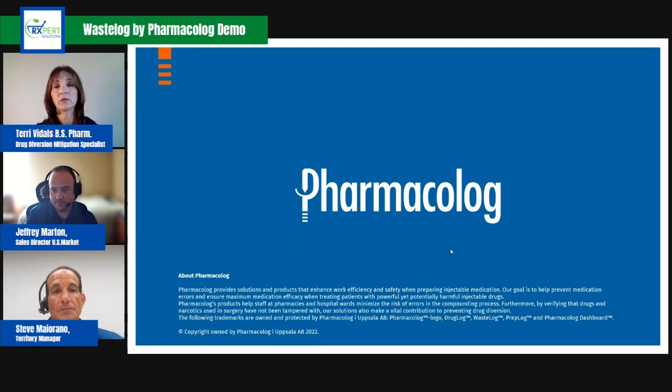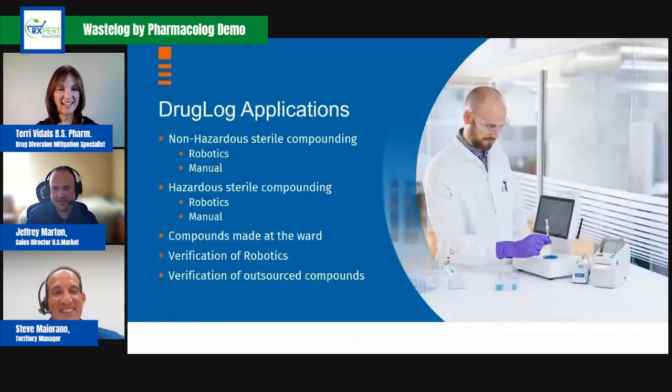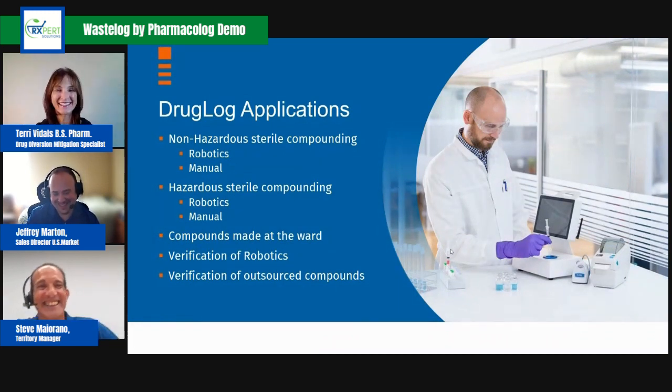Right. Yeah, no, that's a good point. So do you have any customers that use it specifically in the pharmacy for compounding, double checking, and quality assurance? That would be our other device. Oh, okay. All right. So your other device, is it by chance the DrugLog? We had talked about that before and it wasn't in the US. Oh, look at that. You are prepared. Okay, tell me about that.